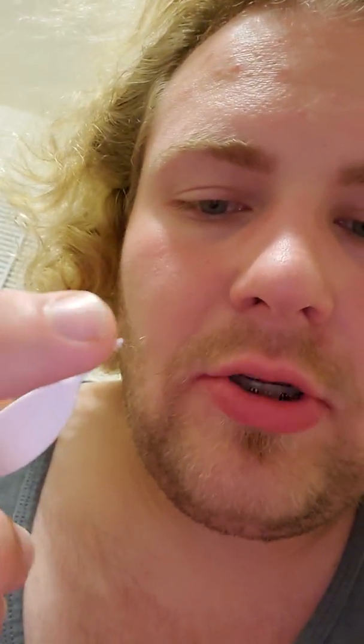But before I do that, I am going to use this side. This is like a little serrated edge. It's not sharp, it's just sharp enough to get between these things and your wires, and you use that to get, like, maybe lettuce that is stuck or any type of food. It pushes the food out. And then I would go with the flossing, and you want to make sure you go in between each tooth and on each side of the upper part of your tooth, because that also traps bacteria, like sugars or whatever.